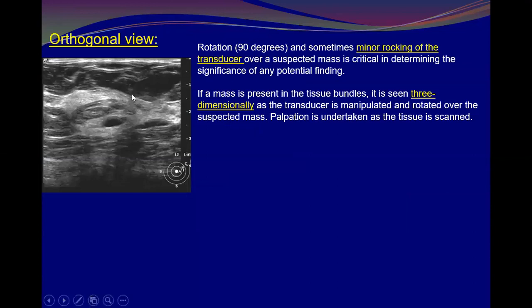Again, this is our patient. Look here, the parenchyma is coming up and elevated. So sometimes the parenchyma looks like or mimics lesions. What I can see are small cysts here. Could you see any abnormality in this image? Any lesion in this image?